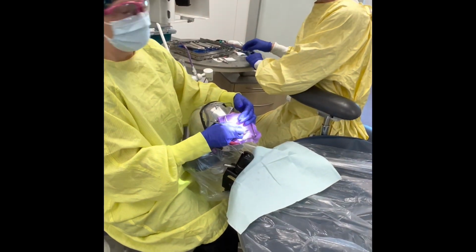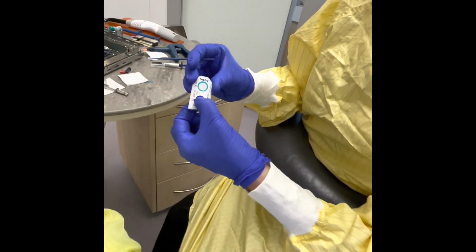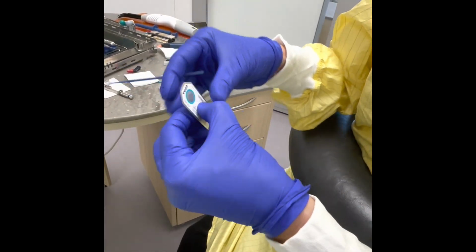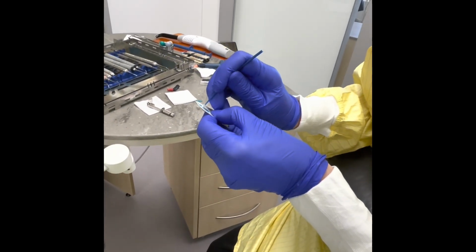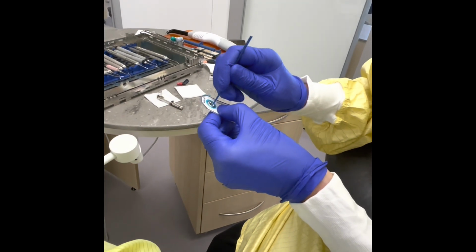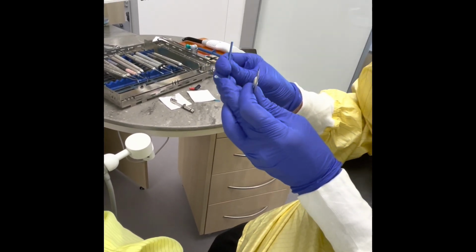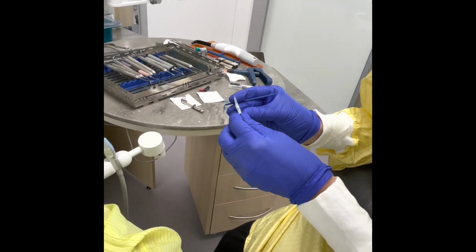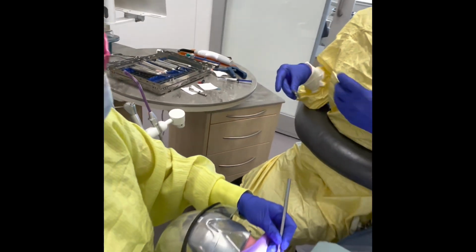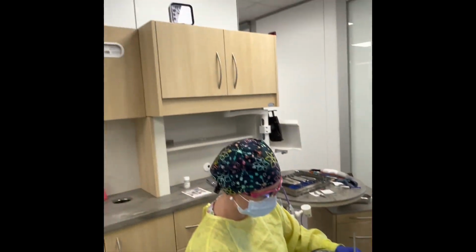So now we're going to start the bonding sequence. Our bond just has a little thing where you have to press to activate it, okay? Then what you can do, sometimes your microtip brush will fit in. I'm just going to put it like this. I'm going to give my brush a little bit of a bend so it's better for Amanda to apply it. And then with this, it has to be applied for 20 seconds. So my job is to ask Amanda, can I watch the clock for you for 20 seconds? Yes, please. Okay.